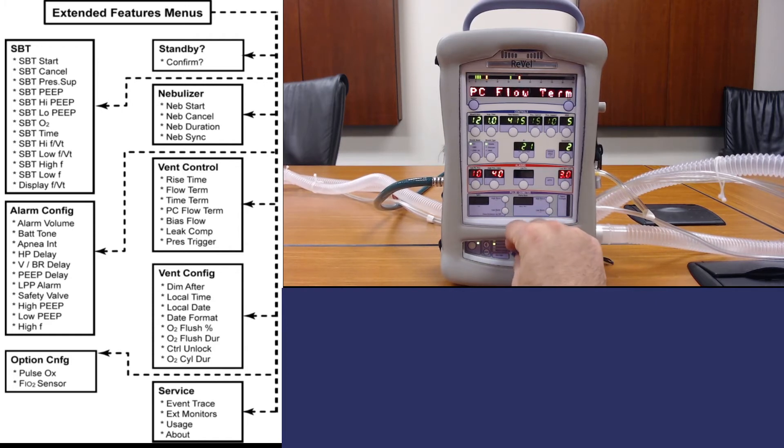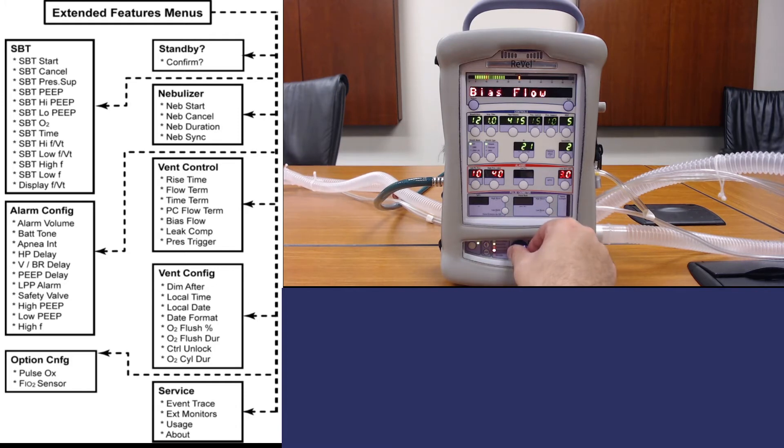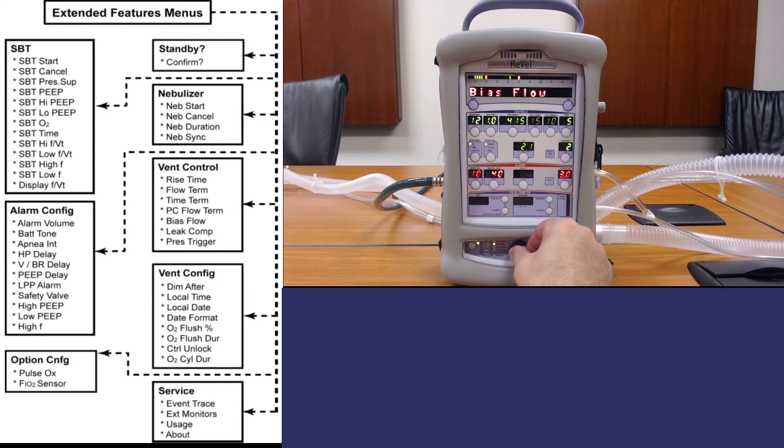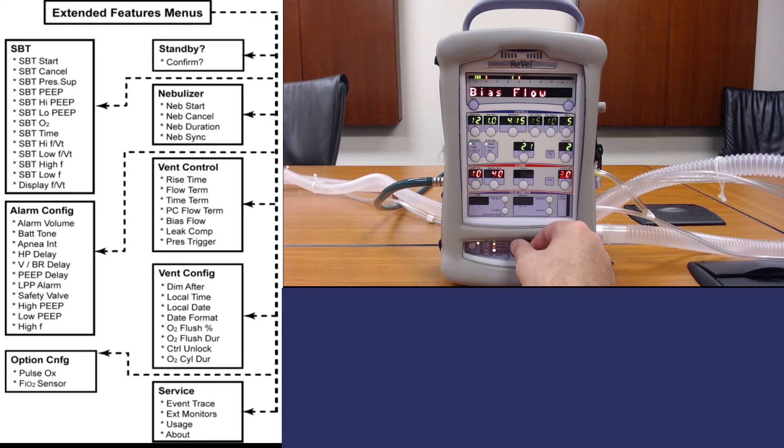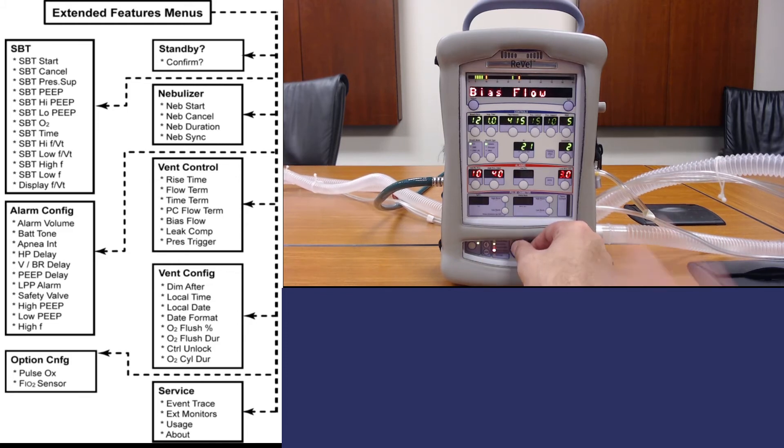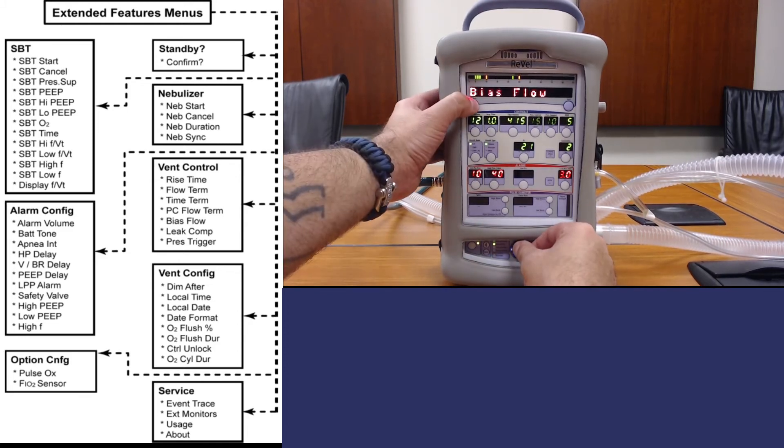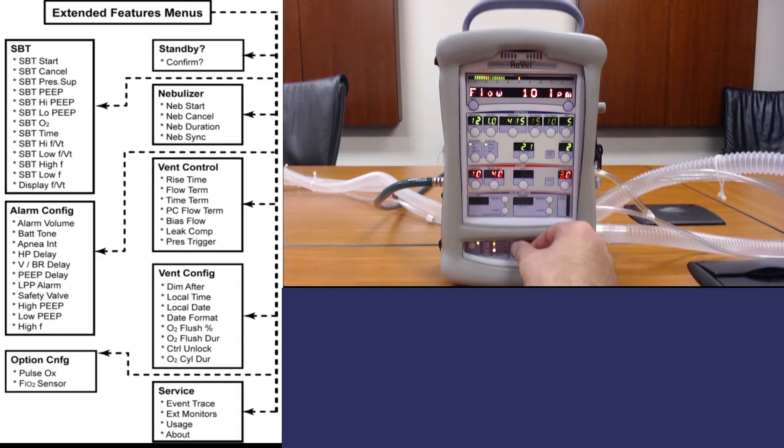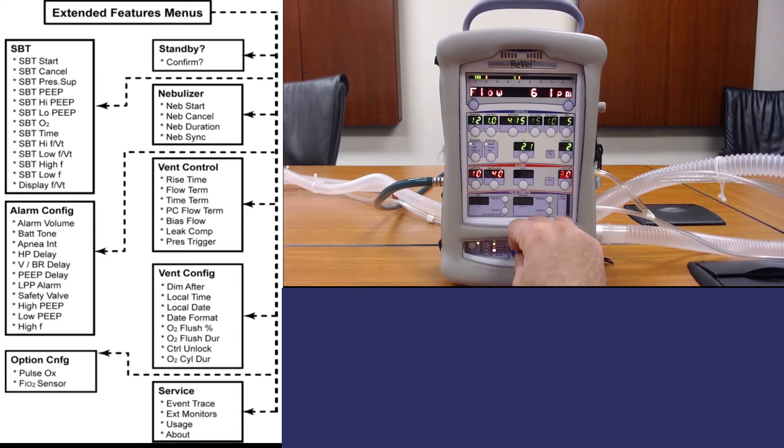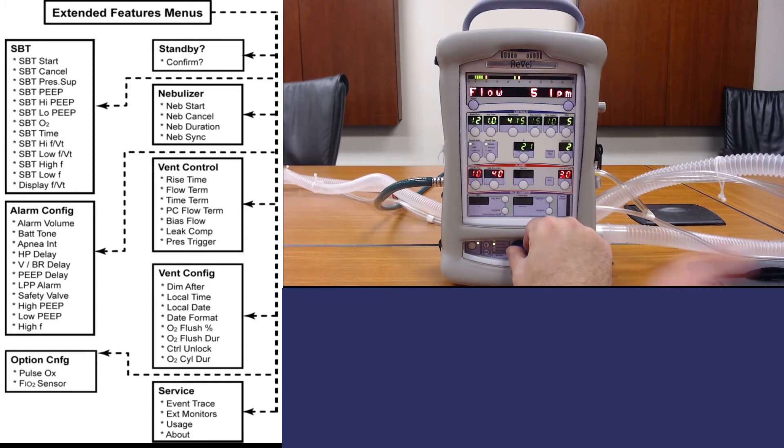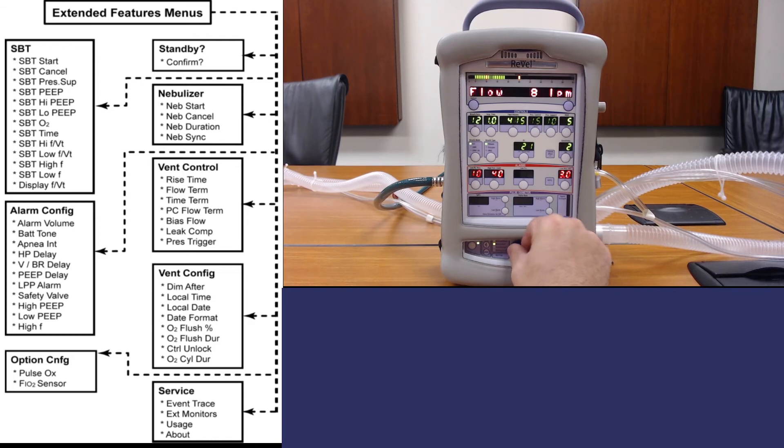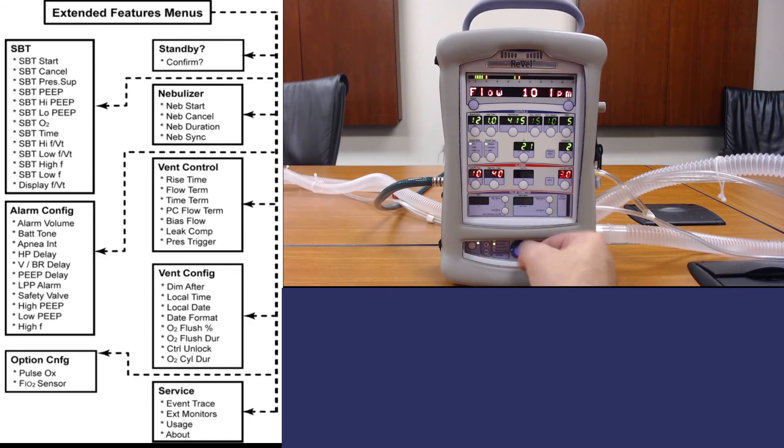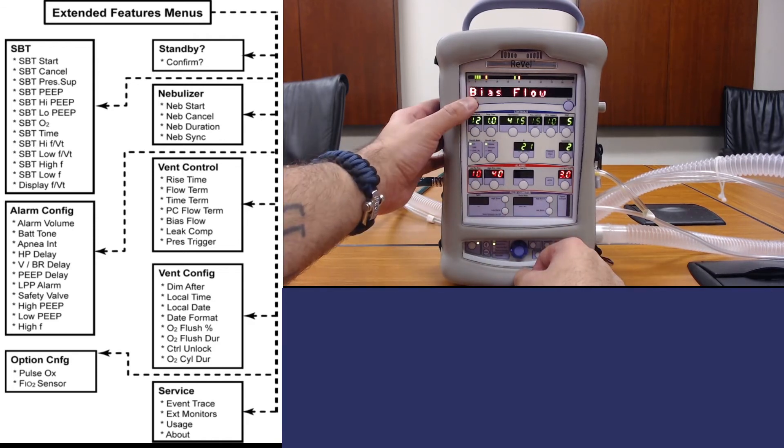The bias flow you will typically utilize if you're trying to use the nebulizer function. It may give you an error message saying the bias flow is under 10. You would need to go into this particular menu and change the flow. Typically it'll be set to 5. If you do a new patient it defaults back to 5. You'd have to change it to 10 using the selector knob and then hitting select.